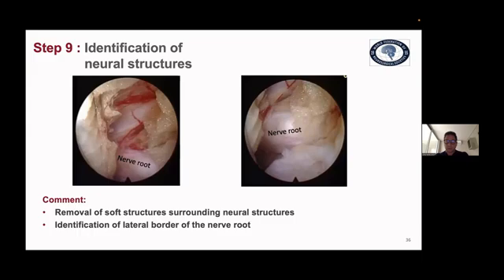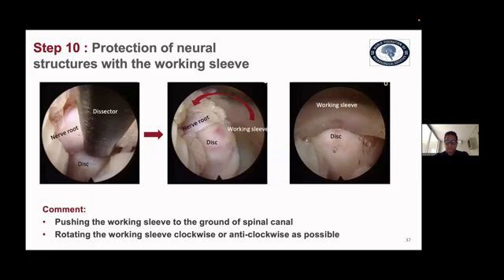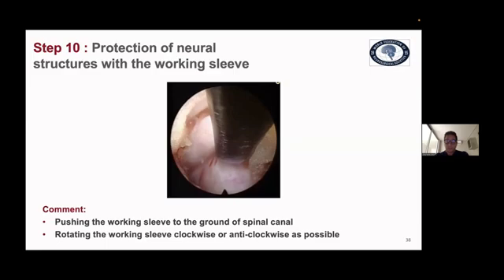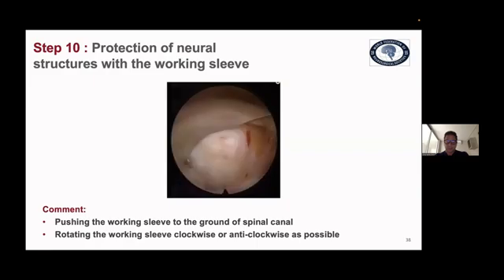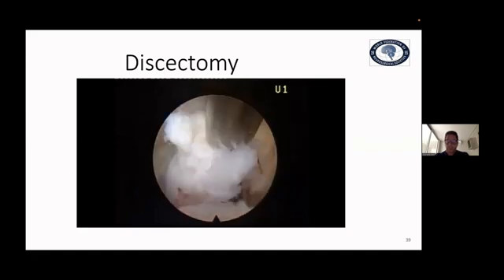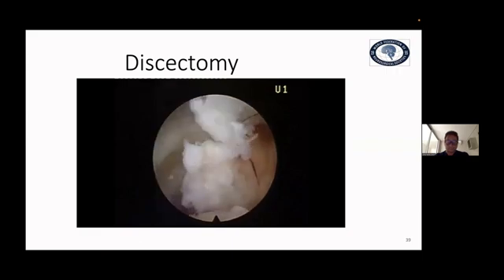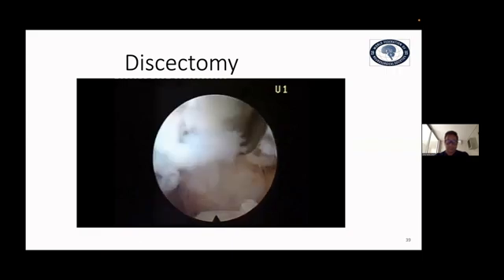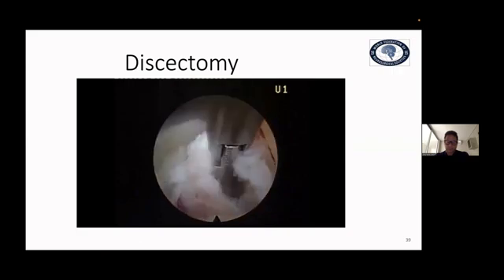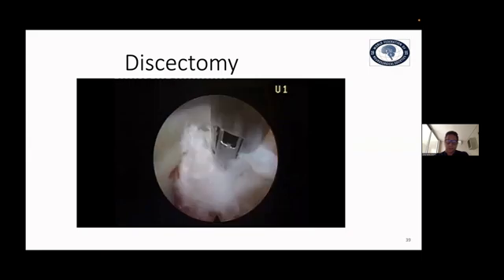So we identify the neural structures and we identify the nerve root. We use the curette to mobilize the nerve, and we use the working sleeve as a nerve retractor. You have to be careful when you rotate the sleeve because you can injure the nerve root. So after rotation, we identify the disc herniation. Finally, we open the PLL and we perform the resection of the disc as we perform normally in an open surgery. We are removing the fragments and we decompress the nerve root. So that would be an L5S1 surgery.